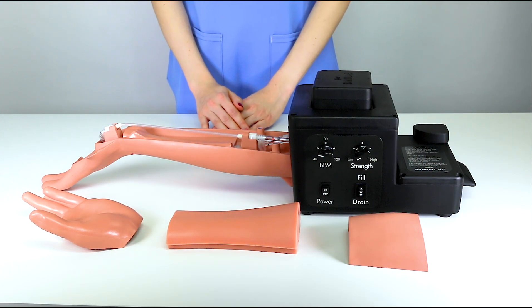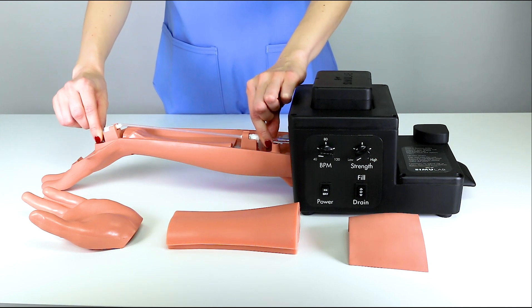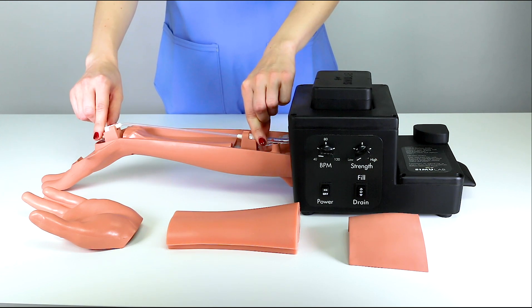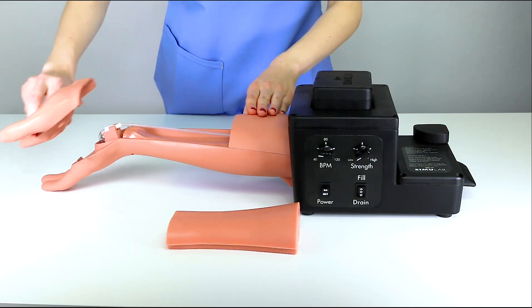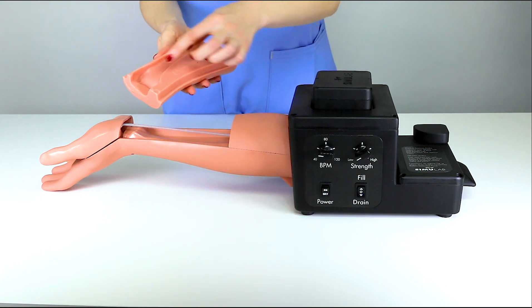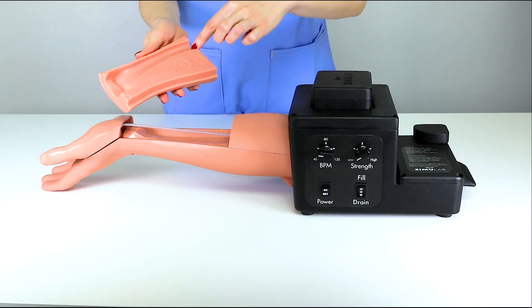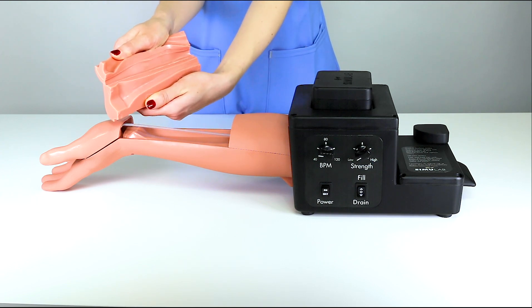To begin, ensure the artery is connected on both ends and the connectors are properly seated in the stands. Replace the arm cap and the hand cover. Observing the tissue, you will notice a cylindrical cutout or channel along the length of the tissue. This is where the artery will be placed.